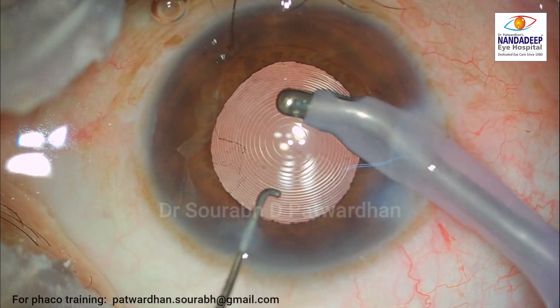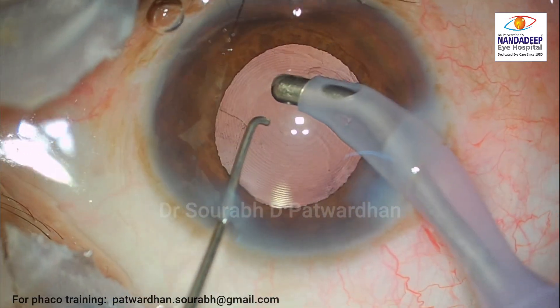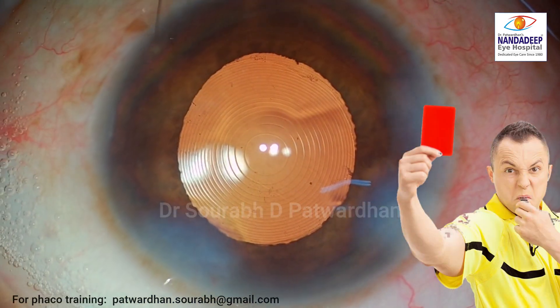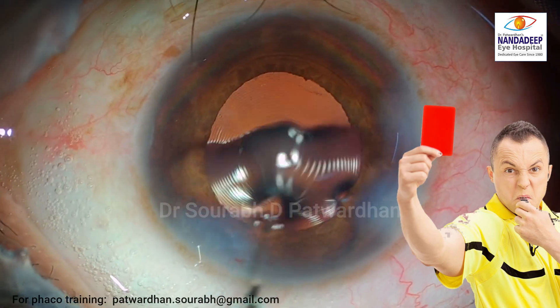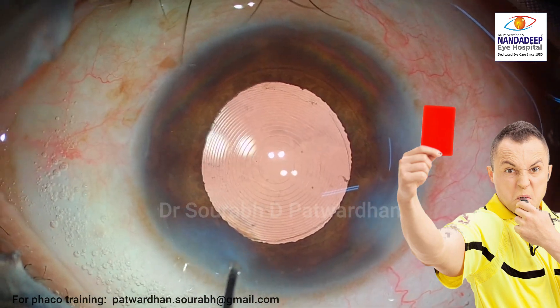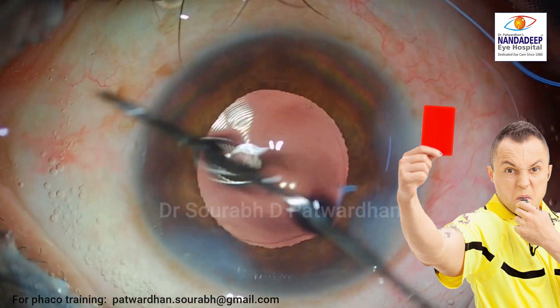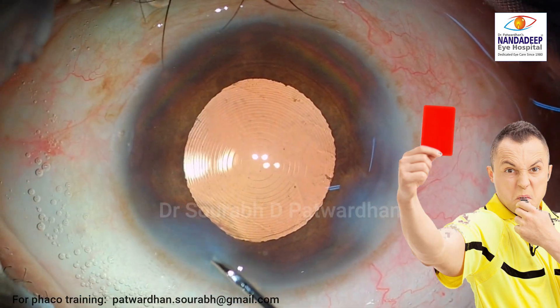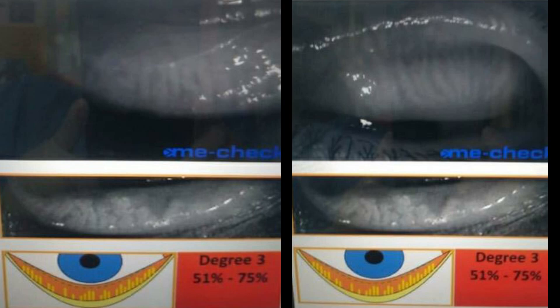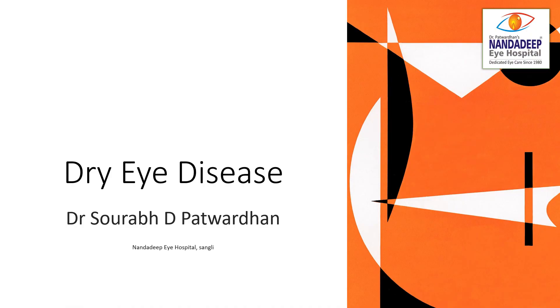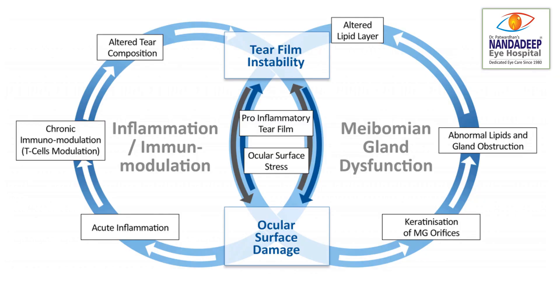This happens sometimes when you apply the lid speculum. I have finished the surgery very well, but I am thinking about these secretions — they looked abnormal and are going to affect this patient's visual quality in the post-operative period. So I must have missed something. When I checked this patient's meibomian glands, I found that there are significant meibomian gland dropouts, and this patient is likely going to develop dry eye disease because of the meibomian gland dysfunction.